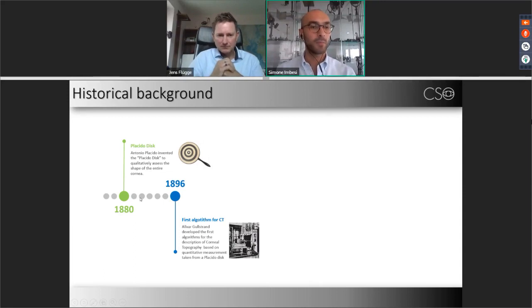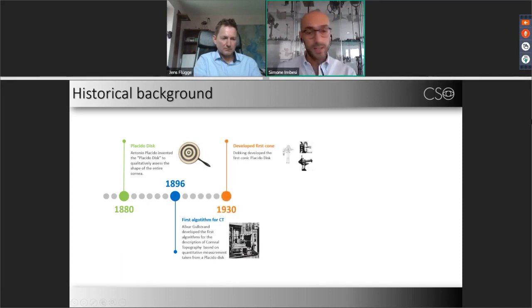Then, in my opinion, one of the most important steps was in 1896, where, thanks to a study of Allvar Gullstrand, an algorithm was developed to take a measurement from the Placido disc. 30 years later, Decking developed the first conic Placido disc, so a Placido disc that has a shape more similar to the one that we see nowadays in topographers.